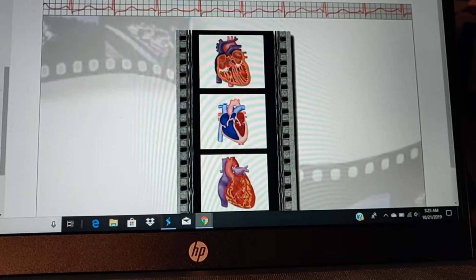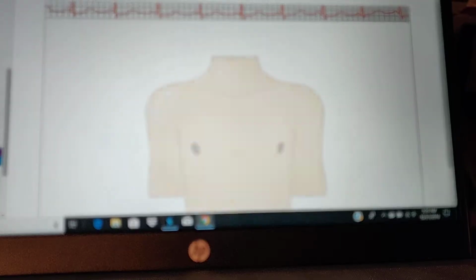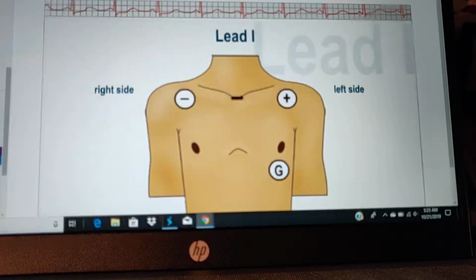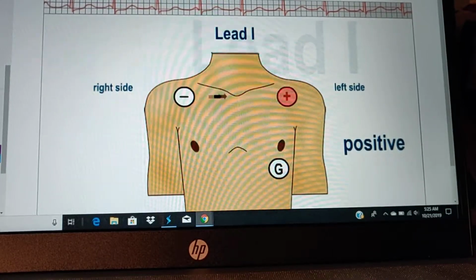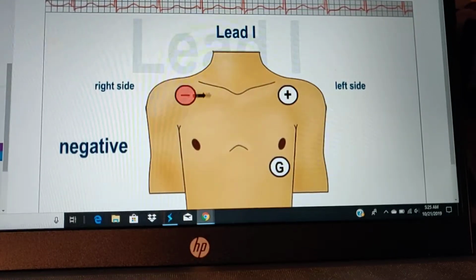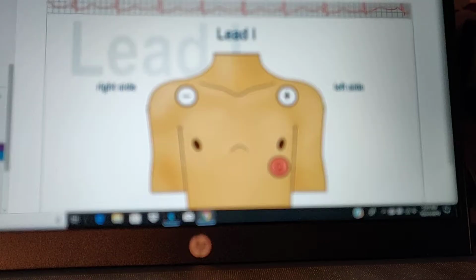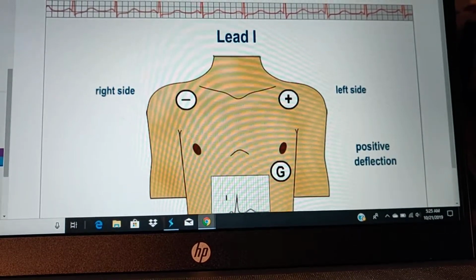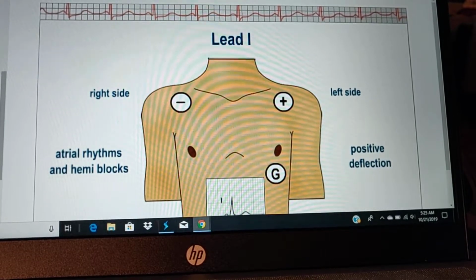Leads allow us different views of the heart. It is somewhat like adjusting the angle of your camera. The view for lead 1 shows current moving from the right to left, from the negative to the positive. So the positive electrode for lead 1 is placed on the left arm or the left side of the chest. The negative electrode is placed on the right arm. The third electrode is a ground. This minimizes electrical activity from other sources. Lead 1 produces a positive deflection on ECG tracings and is helpful in monitoring atrial rhythms and hemiblocks.